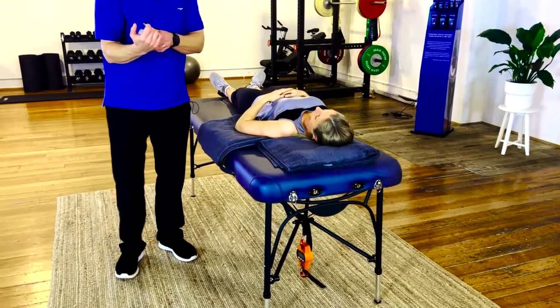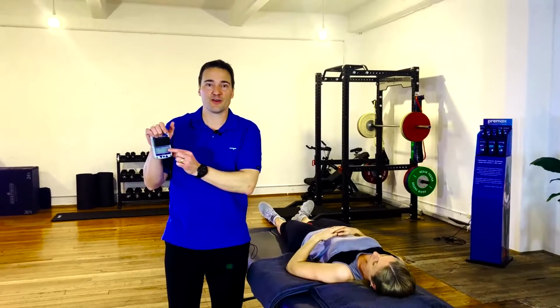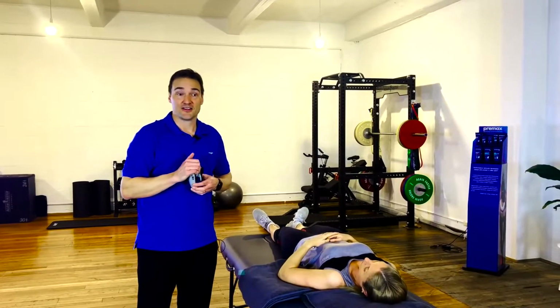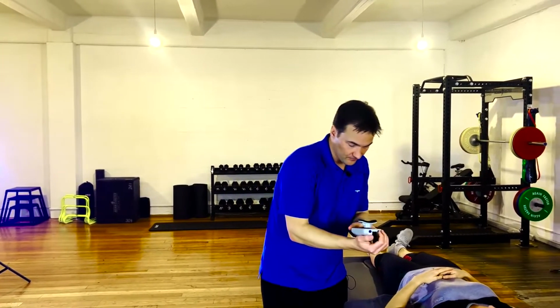So just be aware that time to peak force is not the same as rate of force development, which we can touch on in a minute. Rate of force development is a different measure. Time to peak force is just where they might have got to their peak force at 3 seconds or 2.9 seconds, just before the test ended.